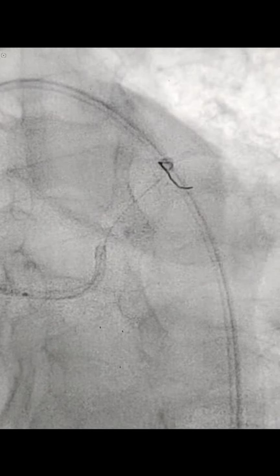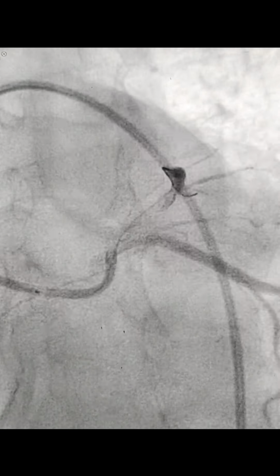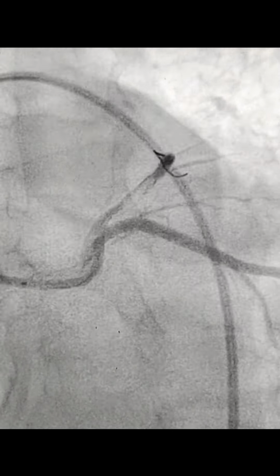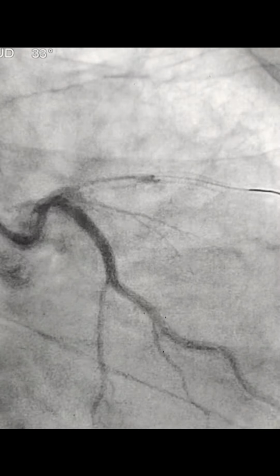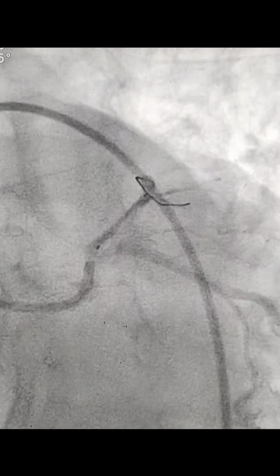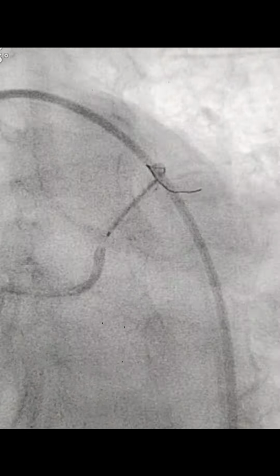We have taken all views, but the only appropriate view to deploy the stent is the caudal view, so that we can see the ostium of the LAD. This is the caudal view. You cannot see it because the LCX is overlapping over there, because it has a separate origin. So this is again the placement of stent in caudal view.